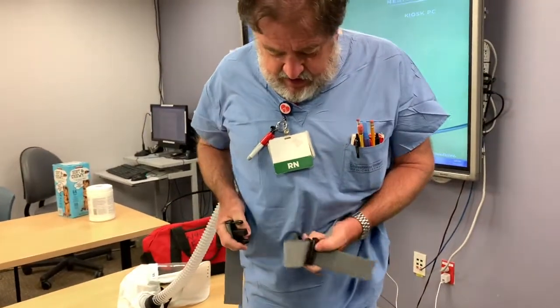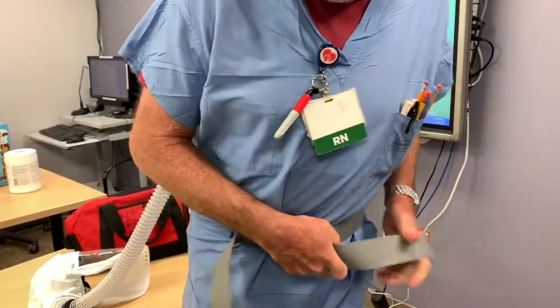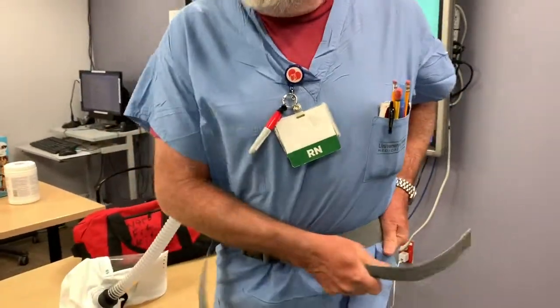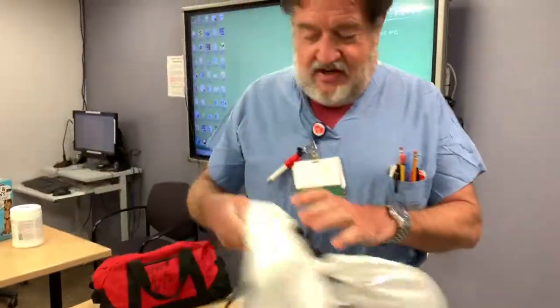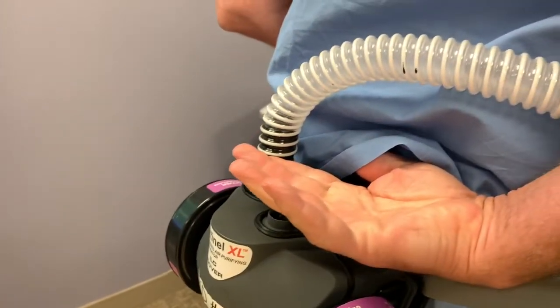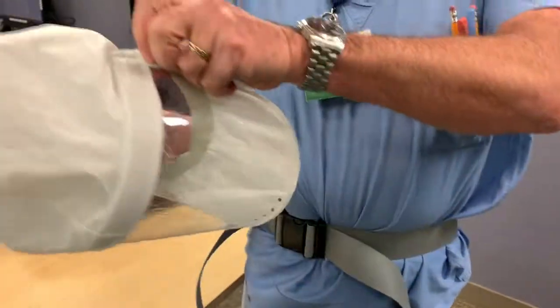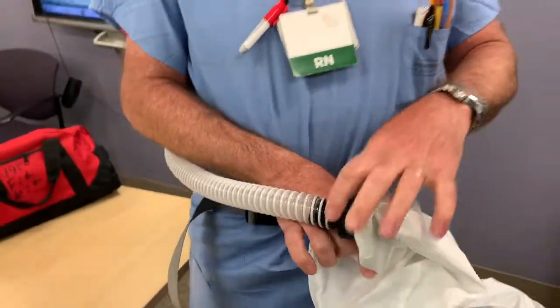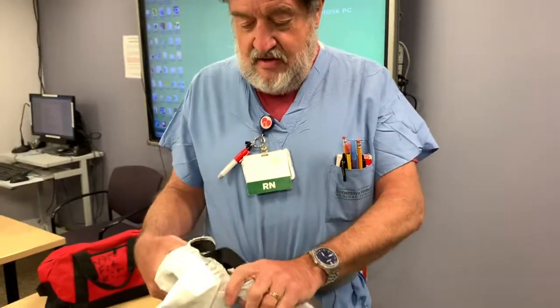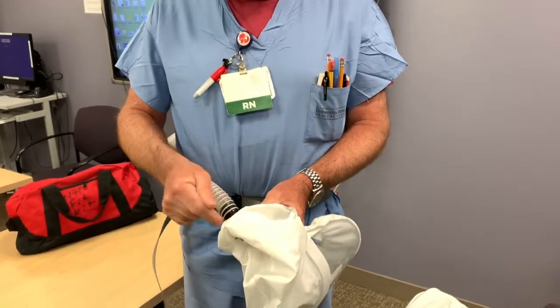The easiest way to wear it is just put it on like this. The biggest problem is they keep trying to fall down. Make sure that it's connected here and connected up here. Those are screw fits, at least on these ones. We have two different masks, two different headsets — make sure you get the one that fits your tubing.